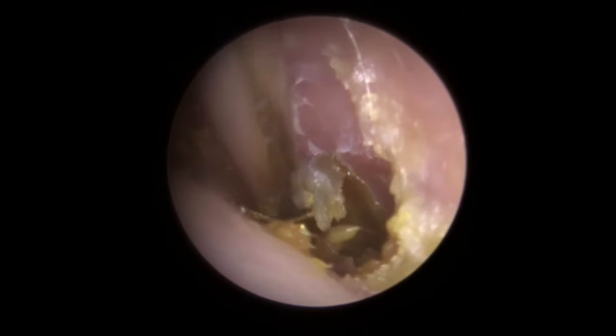We've got a little ridge — see it flicks back. Sometimes when you do a peel, it actually flicks back onto the eardrum. But we know we've detached that section now. The reason it didn't peel off completely is because the top section was holding it on there. Now we've pulled down the top section, we know the right-hand section is loose. So we're going to aim back to that little ridge. We lift up from the bottom section there. So we've detached from the bottom section now — we've loosened off from the little valley in front of the eardrum.